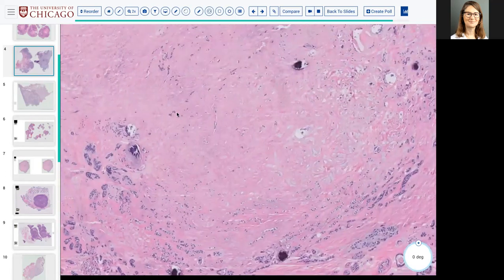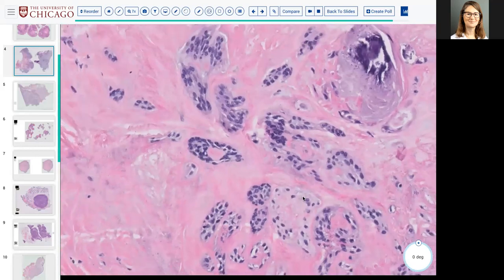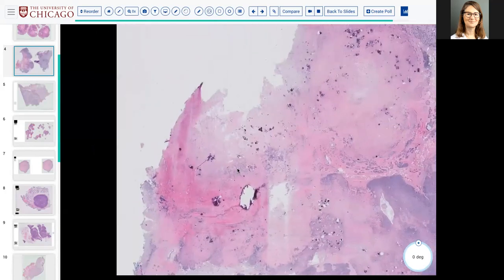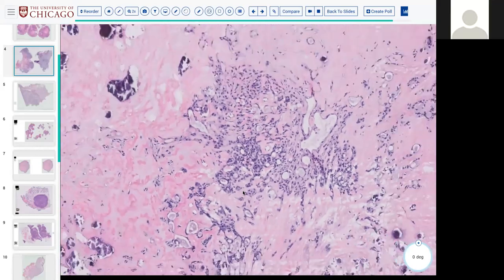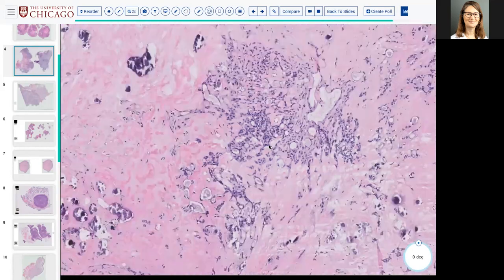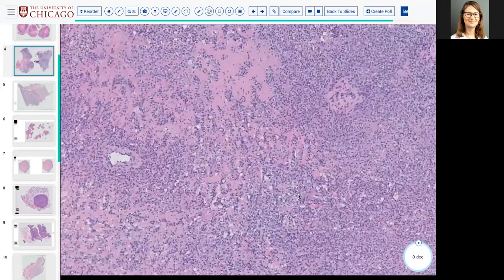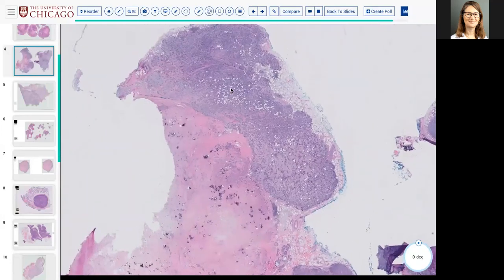In the center was this hyalinized burnt-out nodule with stromal calcification that maybe has some almost duct-like structures. So if I were to venture that this is a carcinoma ex PA, would you buy it? Sure. Yeah. The things that are going to be helpful in this case are: is there a P40-positive myoepithelial layer in these smaller ducts in the hyalinized area, and is there any epithelial layer in the invasive area? That's going to help you decide, one, that this is coming out of a PA, and two, whether this is epimyoep or just myoep.